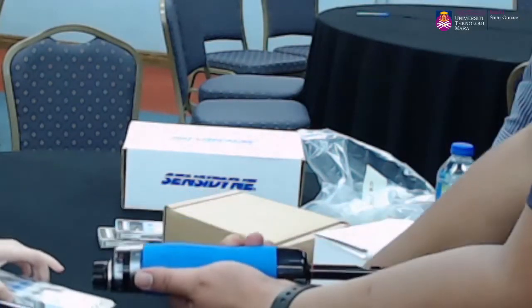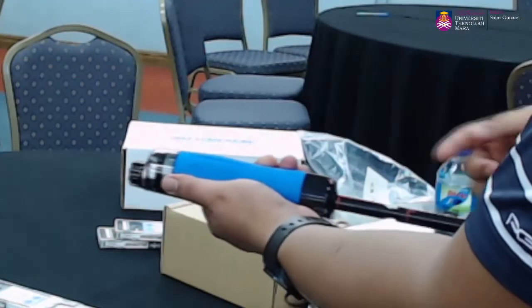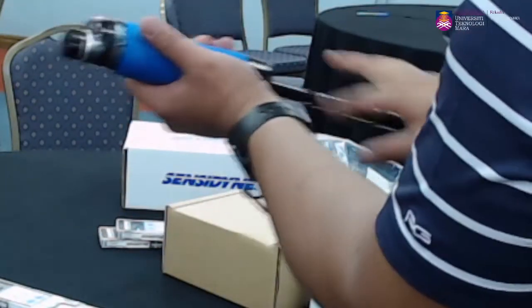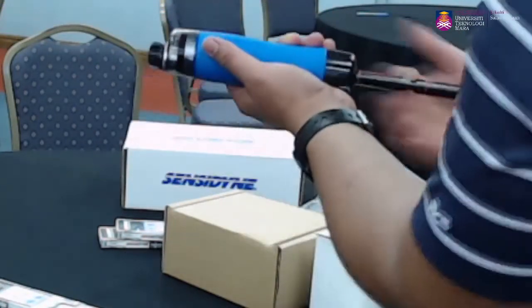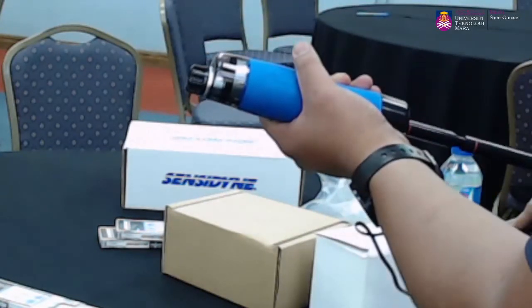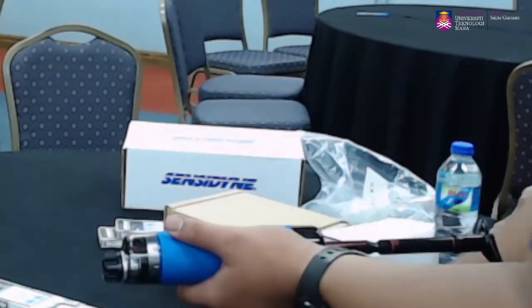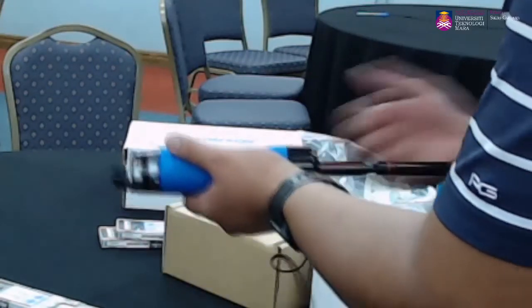Kalau dia kat sini, 3 stroke, means dah kali kedua lah. Dia kena tarik full juga, bukan separuh. Satu stroke means satu tarik habis. Half stroke means separuh. Satu stroke tu bermaknanya 2 kali, 100 ml. Kalau separuh tu 50 ml lah. Kalau kita tengok kat sini, dia tunjuk in terms of 2.5 pump stroke, means 2 kali kita tarik.